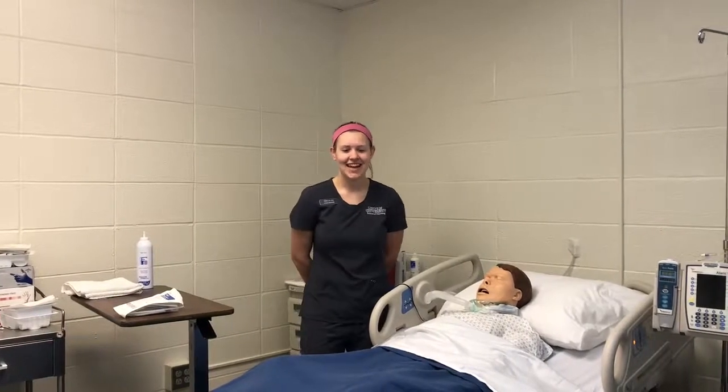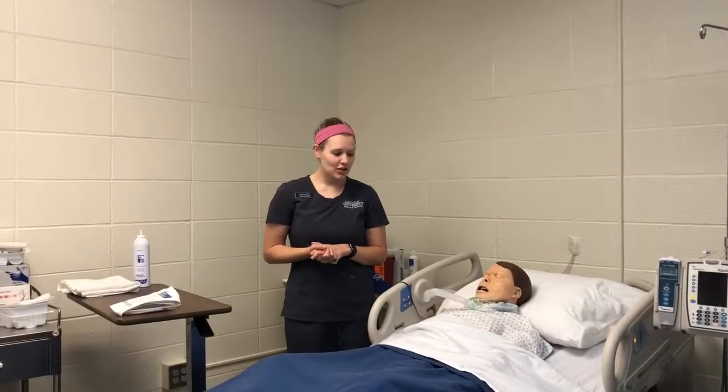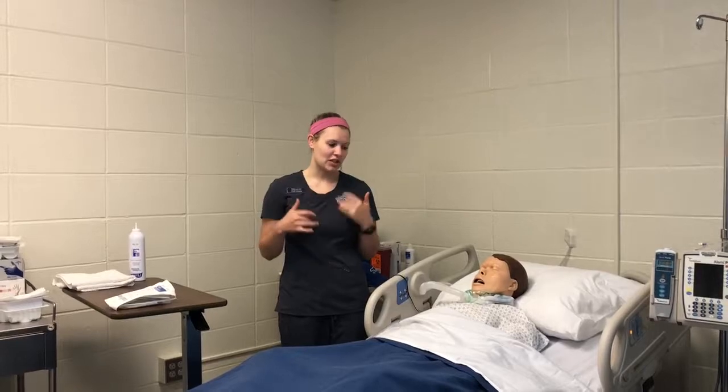My name is Tristan, and I'm going to be doing a trach suctioning and trach care video today. So the first thing that I would want to do is assess my patient for the need for suction and a trach care change, or a trach change.